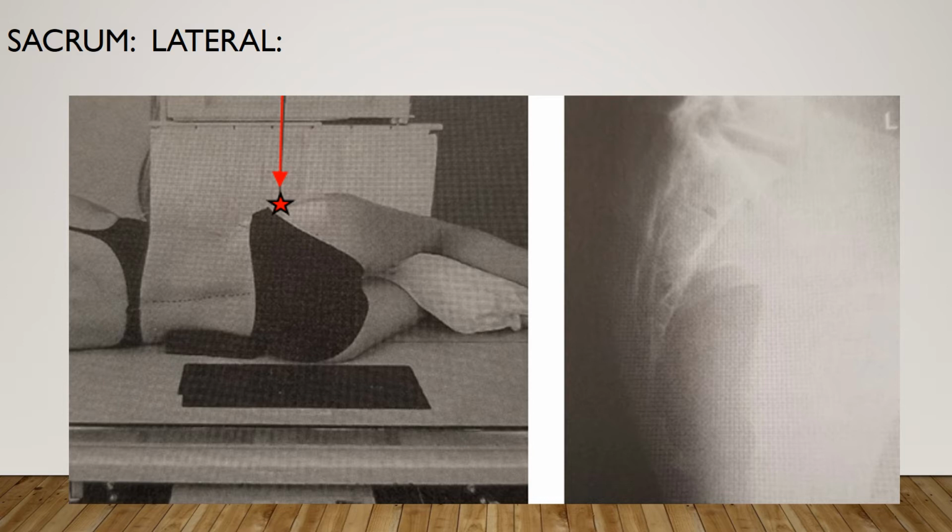On image evaluation, you're going to see a lateral view of the sacrum and coccyx, a lateral view of L5-S1 intervertebral joint, no rotation evident by greater sciatic notches and femoral head superimposition. The entire sacrum and coccyx are going to be included, and you're going to have optimal density and contrast, no motion, and the trabecular markings are going to be clearly demonstrated.